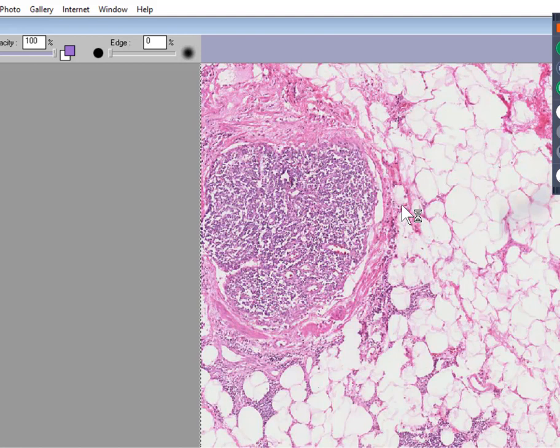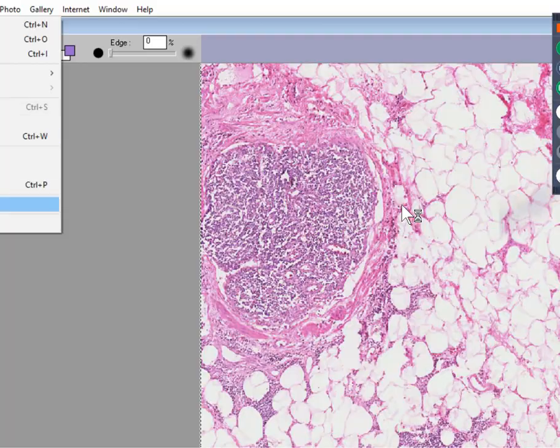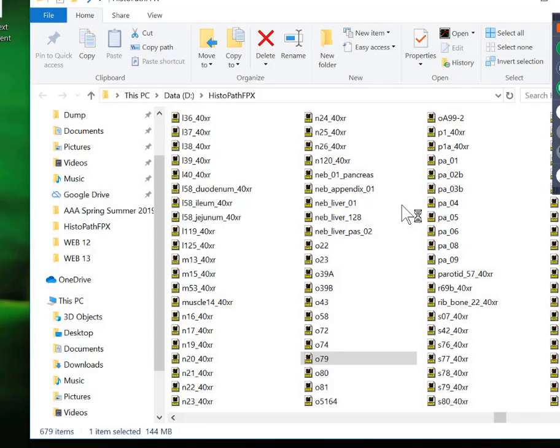If the papillary tumor involved only the inside or the lumen or the mucosa of the bladder, they might just remove it or perhaps give it some type of other treatment and not remove the entire bladder. But this bladder needs to come out. And that's why we got it. Because it did come out and it got into the hands of the University of Iowa, and then they took some very nice pictures of it. Okay, well, we've done transitional cell carcinomas that are papillary. We've got one that's invasive.